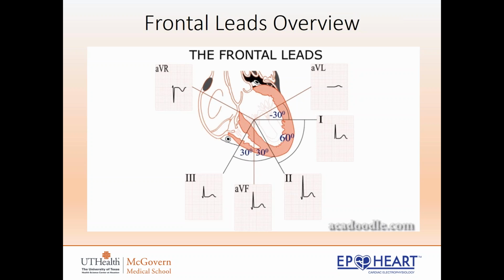Finally, we will consider atrial depolarization in the frontal leads. Atrial depolarization vectors are much more prominent in the frontal plane compared to the transverse plane, and P waves tend to be more prominent in these leads. As the SA node is situated high in the right atrium, atrial depolarization spreads predominantly downwards and to the left in this plane, producing strongly positive P waves in the left-sided and inferior leads, particularly in lead 2. As these forces are moving away from lead AVR, the P wave is negative in this lead.